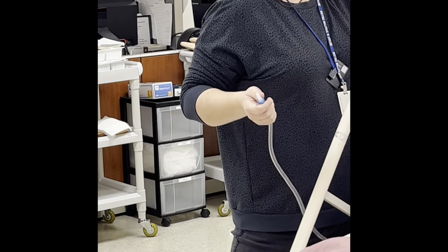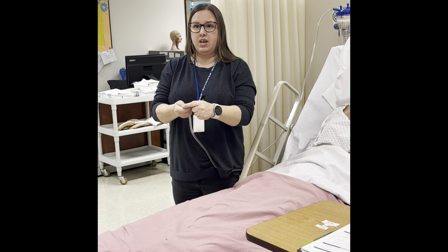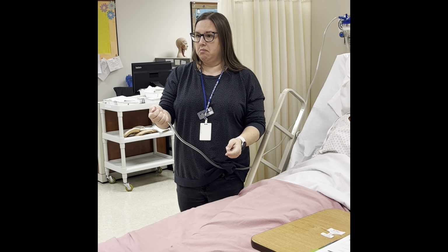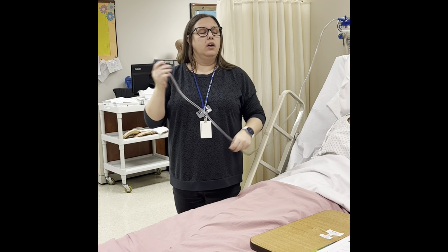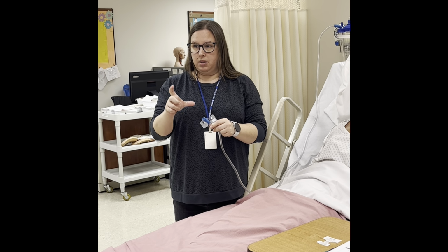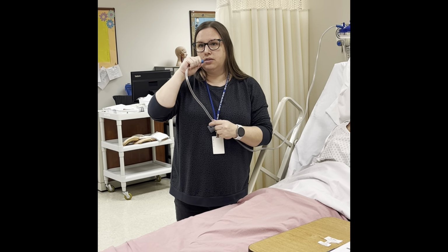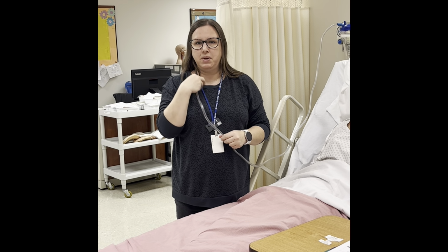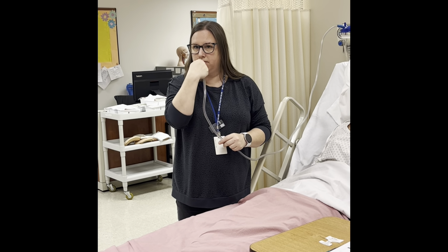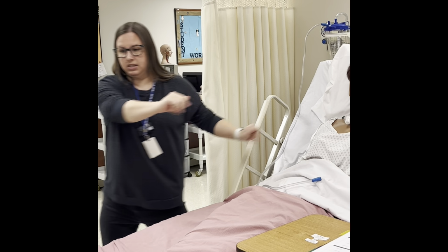So we wanna turn this on. When we turn it on, if we were to hit it to regular suction, just like your vacuum, we could just feel the end and feel that it's sucking. Great, beautiful. But in real life, I would put one of the Yankauers, one of the mouth suctions, like the dentist. So we could get any saliva, or if our patient starts to puke, we could start vacuuming up some puke that's coming. So our thing is on and we're ready to go.